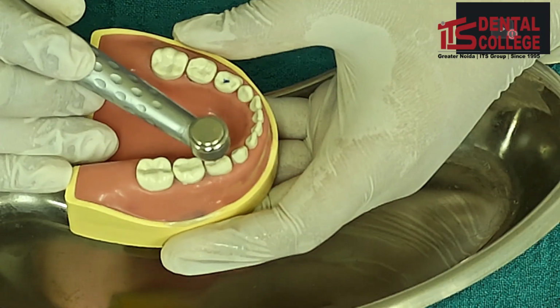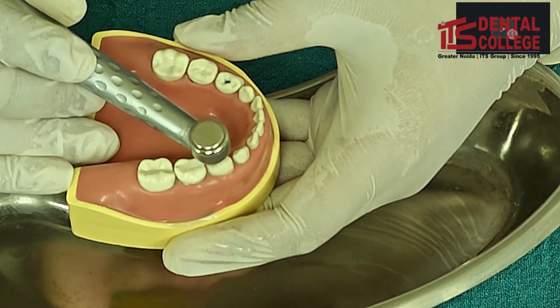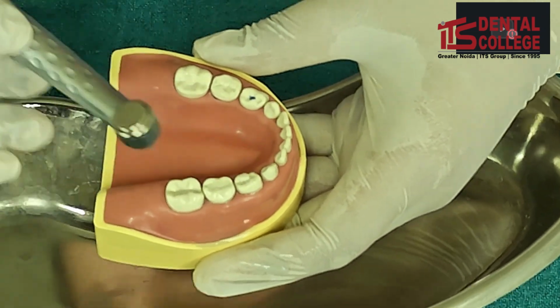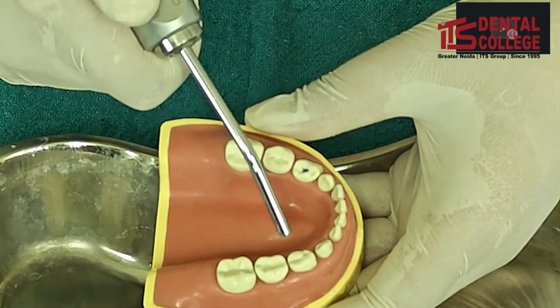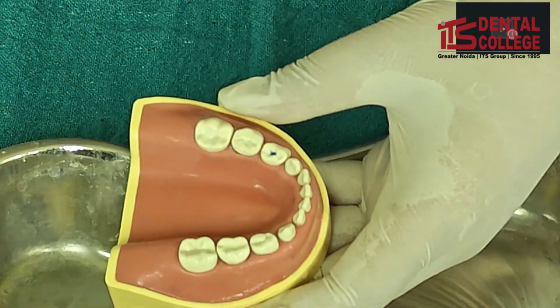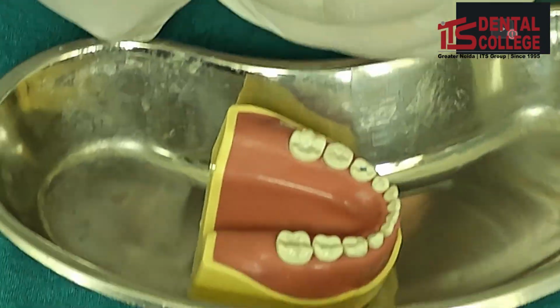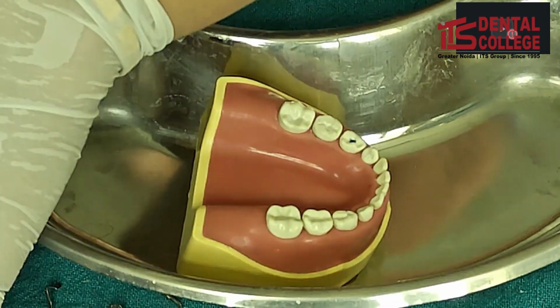The cavity here was limited to the occlusal pit. We can now use a straight burr so as to widen the cavity.